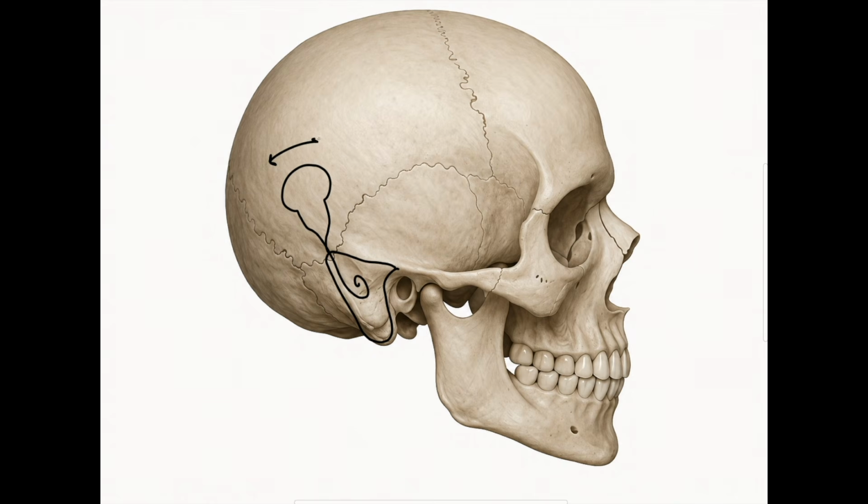We don't want the implant to be wiggling side to side because that can cause the electrode to dislodge or migrate. So we take advantage of a couple of cranial sutures where the periosteum is tightly adherent in order to create your tight subperiosteal pocket. Anteriorly is the squamosal suture line, and posteriorly you have the parietomastoid suture, which gives way to the lambdoid suture. So what you really want is to place your implant between these suture lines in order to minimize device migration. Placing it above the temporal line, which is dotted out in red, also prevents the device from shifting downward.